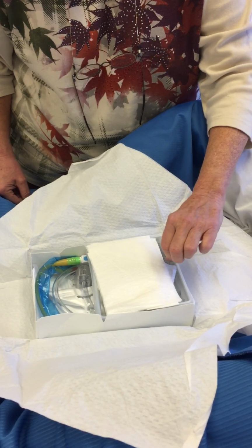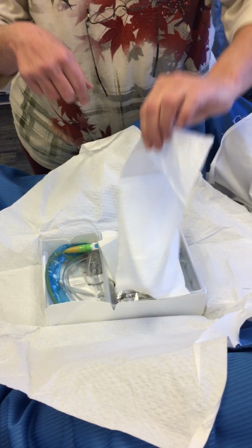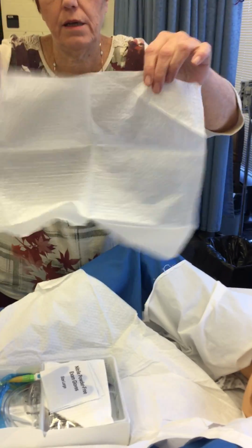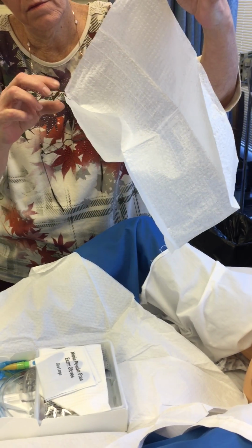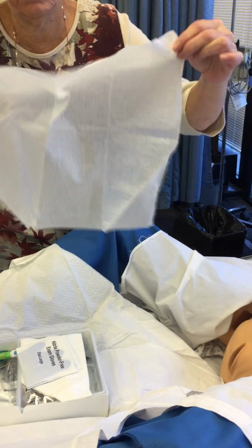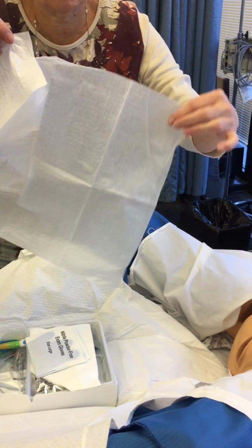Depending on what's on top of your sterile field, or in your package rather, this is going to go under your patient. This is the waterproof drape. So 1 inch, you can touch around the sides.